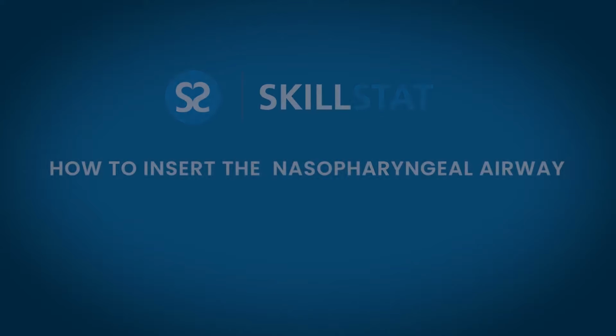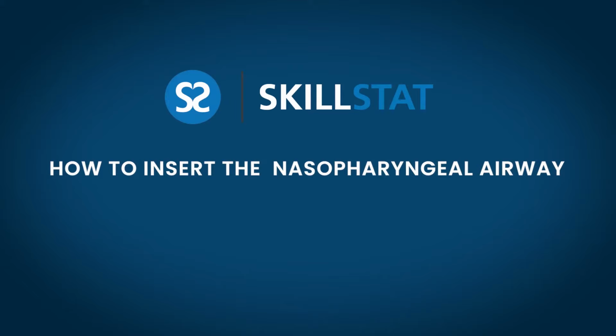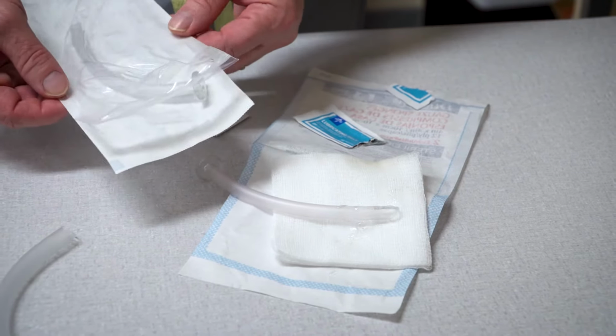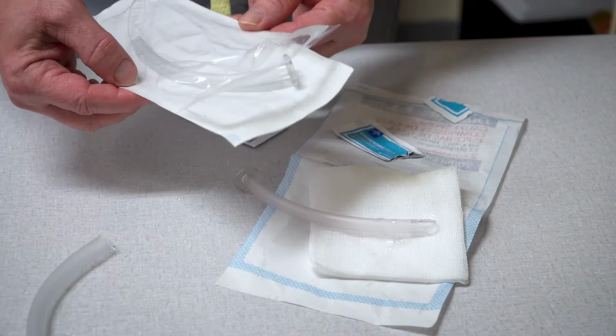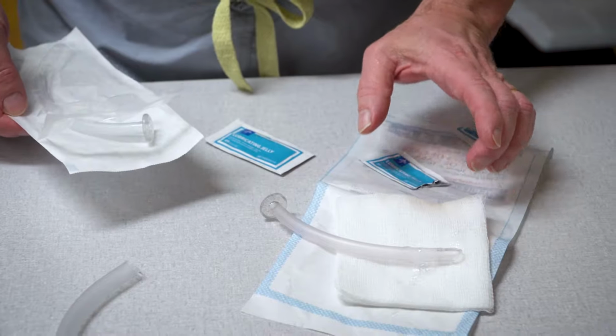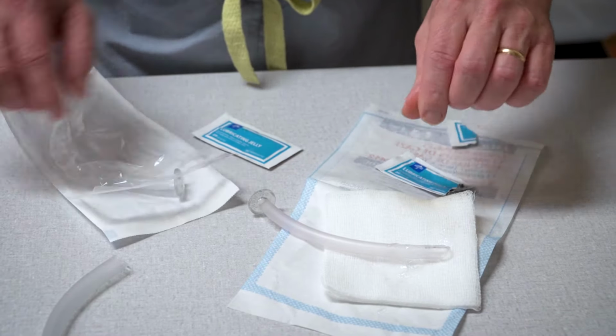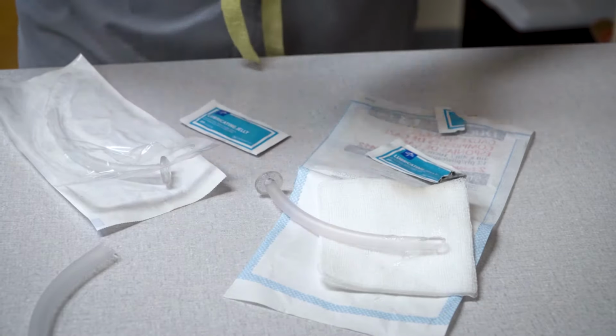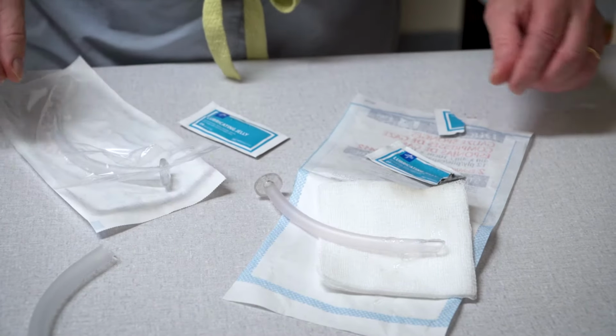Today I'm going to show you how to insert the nasopharyngeal airway. Okay, I have some examples here on the table. So the nasal airways are sterile inside the package, and the way to keep them sterile would be to just open the package and then use sterile gauze with the lubricant on it to put it onto the airway, and then you can just hold the end so that basically the portion that's going into the patient would remain sterile.